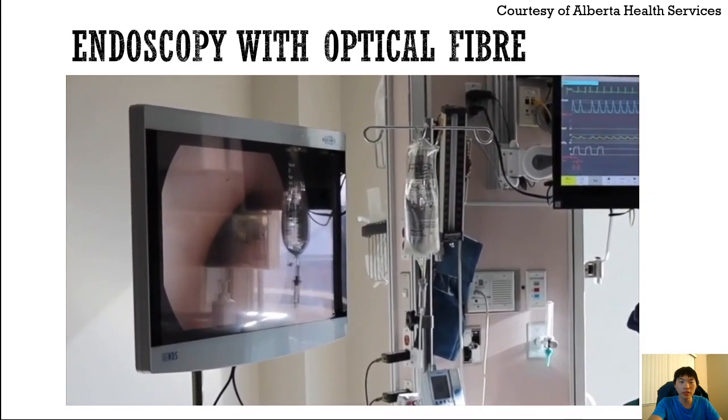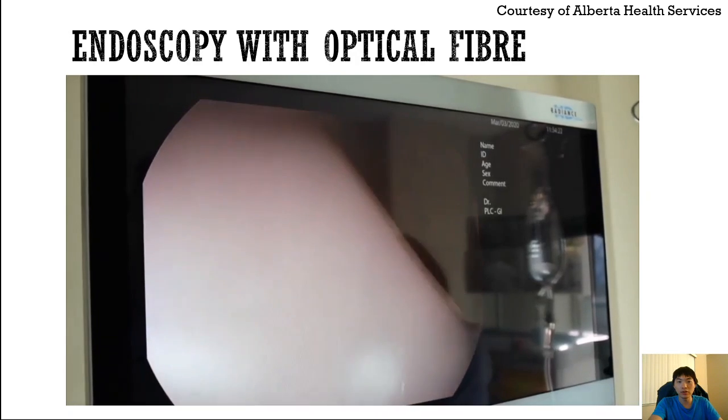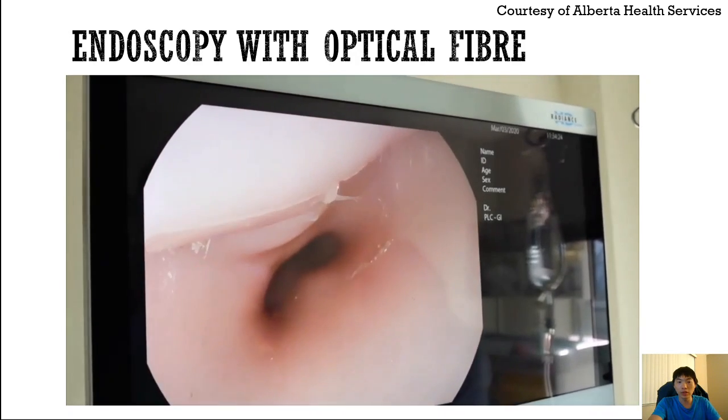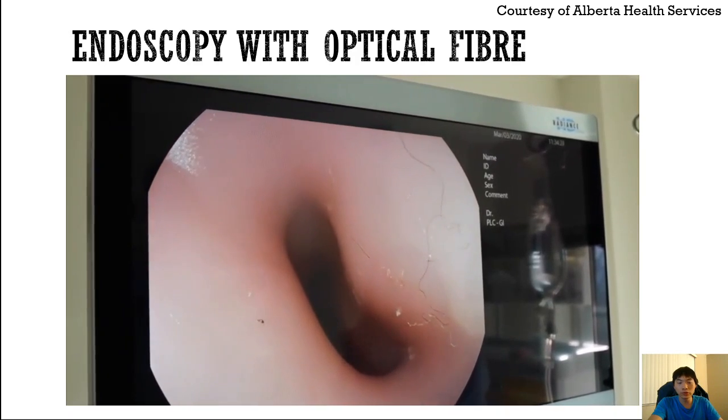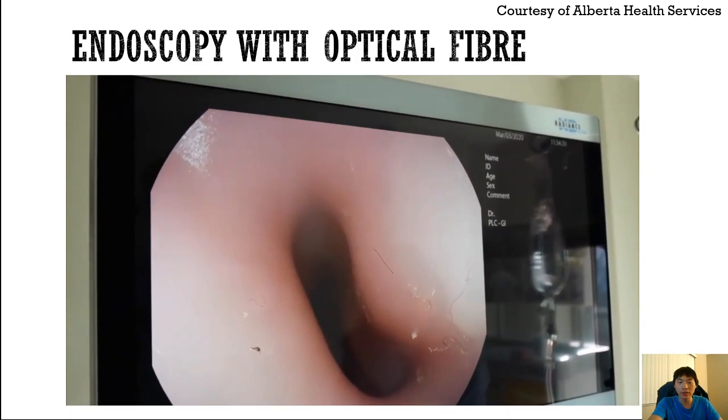As you insert the endoscope down the esophagus, you can see the optical images of the inner surface of the esophagus, and that can be very useful in looking at the condition of the esophagus and also any diseases inside the esophagus. So here comes the next question.